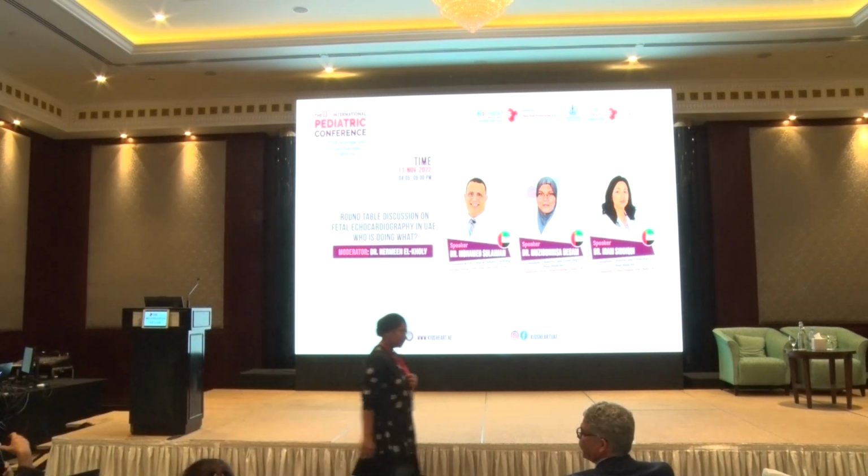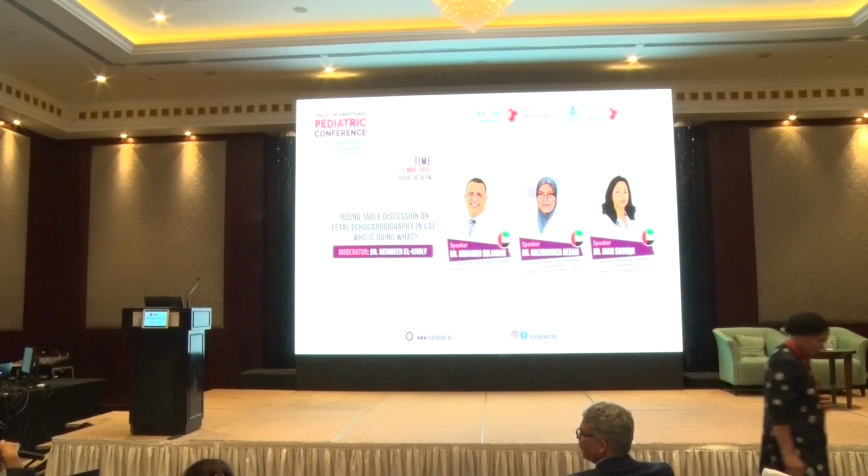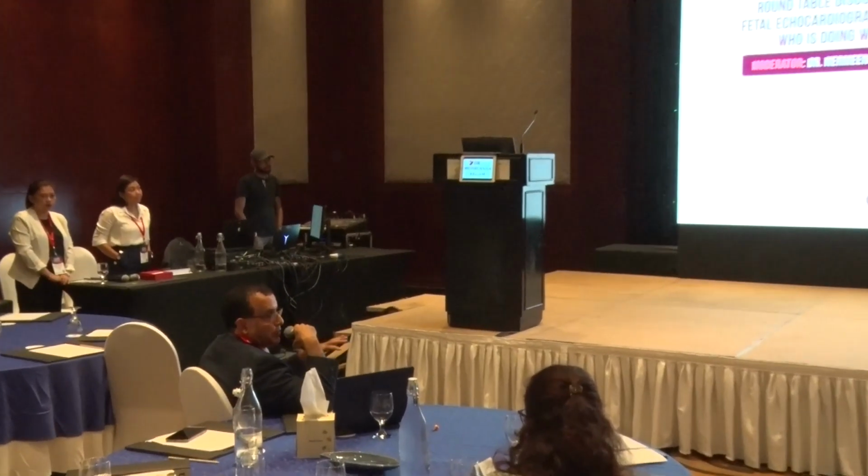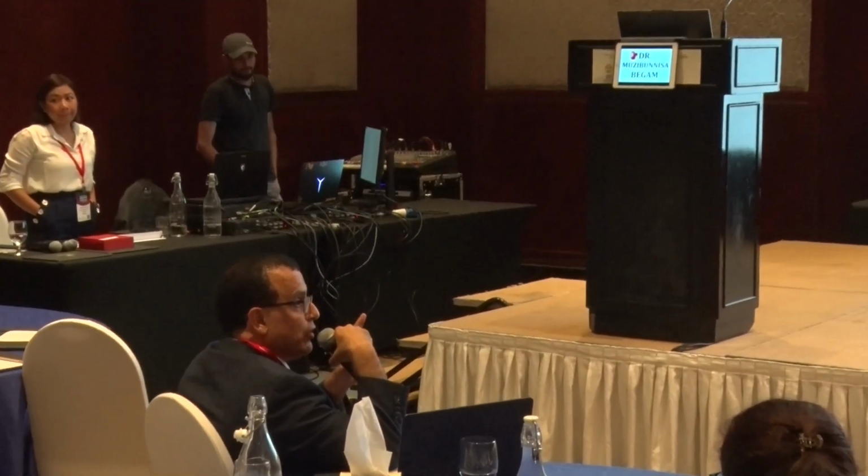Thank you very much. It was very, very interesting cases. By the way, I just want to mention, when we do fetal anomaly scan, we don't really analyze what I'm gonna do with this information. Now, I am seeing it's just like a Google map. Google map should take me to show me the neighborhood, where is the street, where I may not pass by that street. I may not need to worry about the IVC or the SVC or whatever anatomy I may see. I may not do any intervention for it.